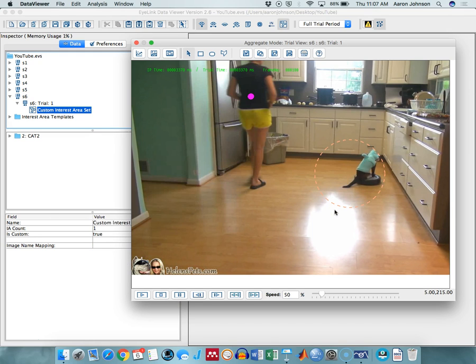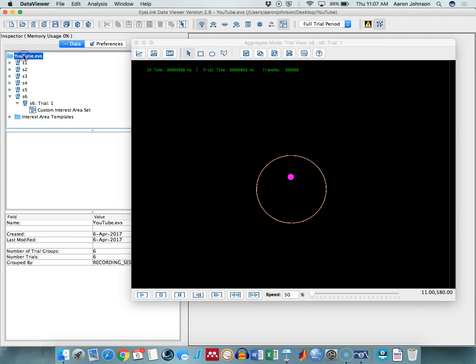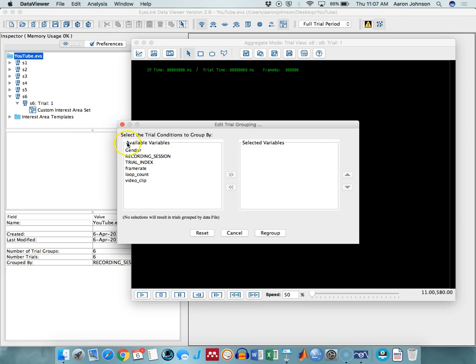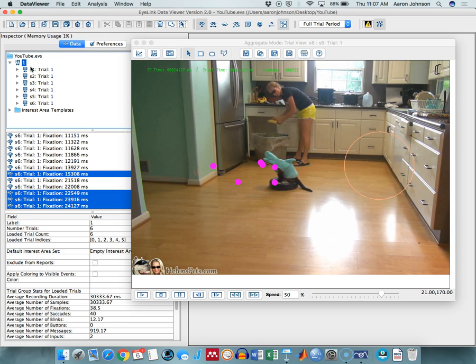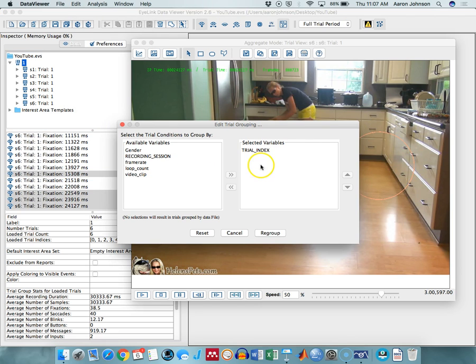That's fine. And now if I play my video, which I have to group here. I'm going to group. So if I go File, Trial Grouping, and I'm just going to group by trial index for now. And then regroup. So again, what I'm doing now is showing all 6 subjects at the same time.